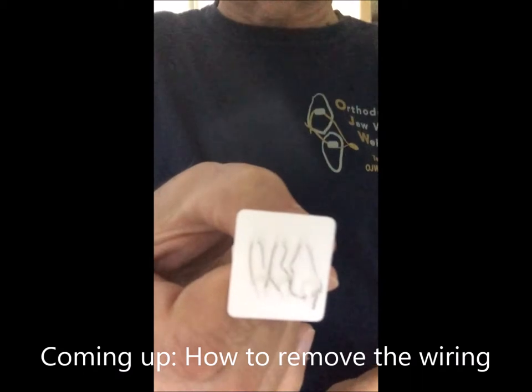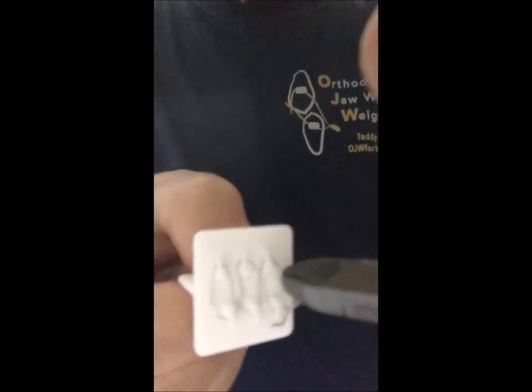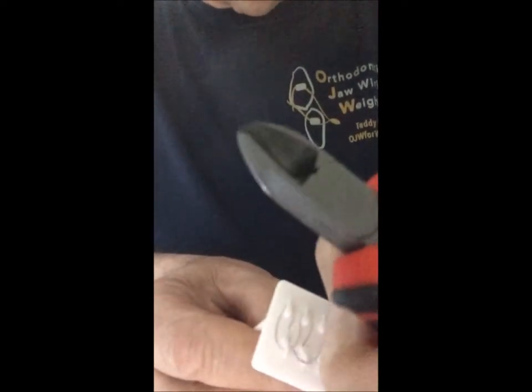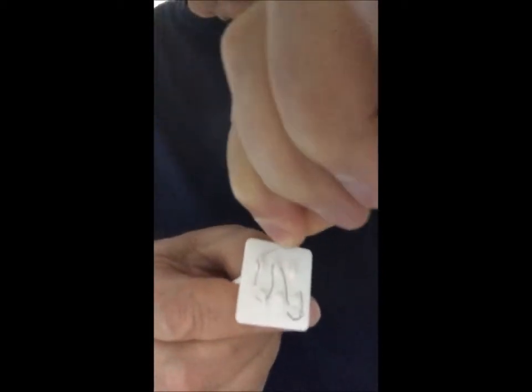That's what the jaw wiring will look like. Removing the wire is simple. You take the wire cutter, find the front-most piece of wire, snip it, and then with your finger or the instrument, you simply unravel what you wired before. That's it. Five seconds.